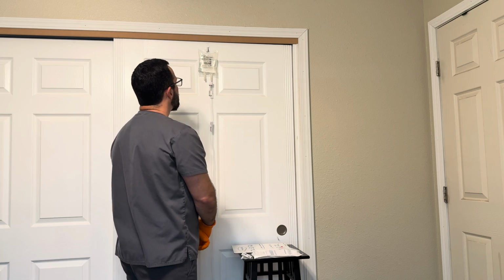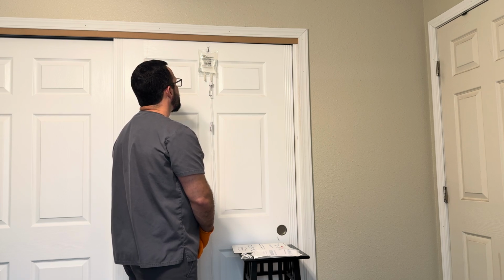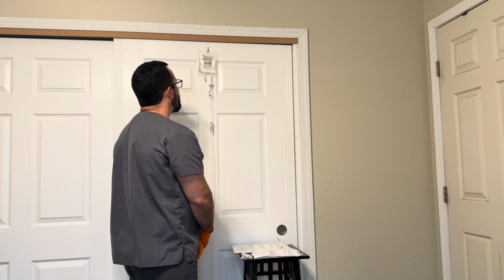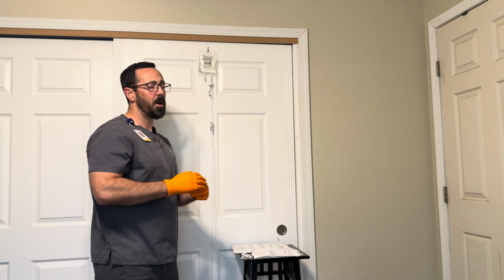All right, so I'm starting now. Okay, so I'm at 42 drops per minute.